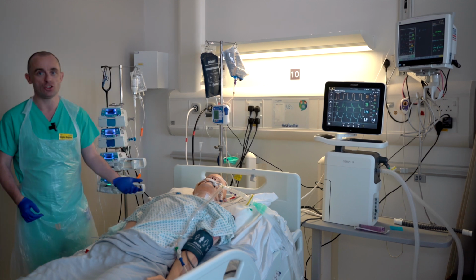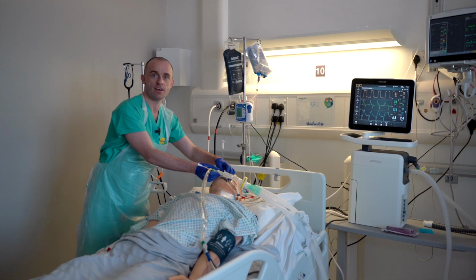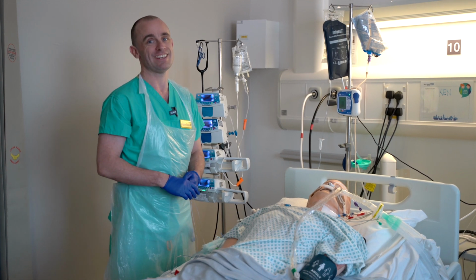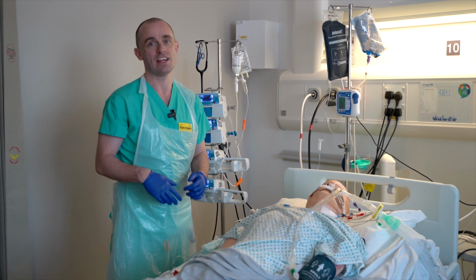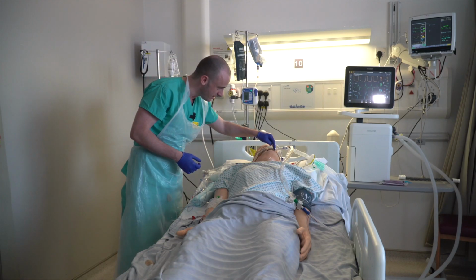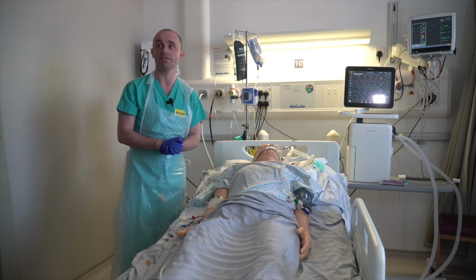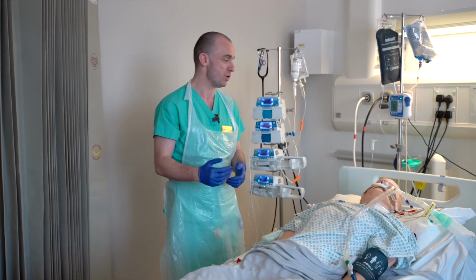With an ET tube, you'll see that it's put in, and there are markings down the side. It's important not to assume that just because something is there, particularly when it comes to the airway, that it's necessarily in the right place. You should always start off by checking that it is where you left it. You can see here that at the teeth, it's 24 centimetres. If I could just ask my nursing colleague on the chart where it was documented that it was left. So it was documented 24 centimetres. Okay, so I'm happy that the tube has not moved.